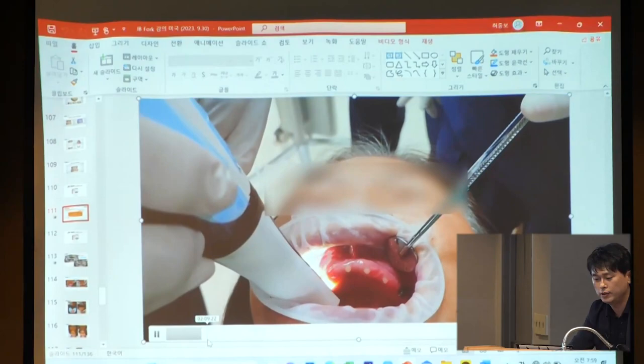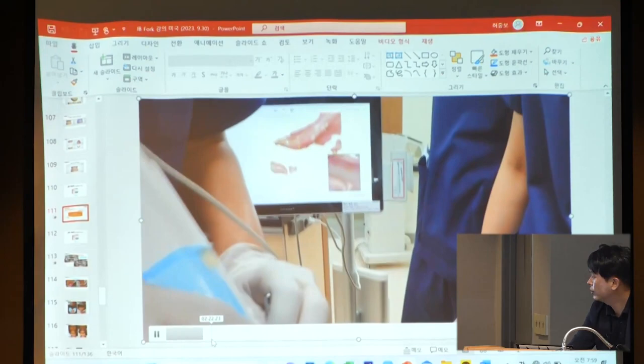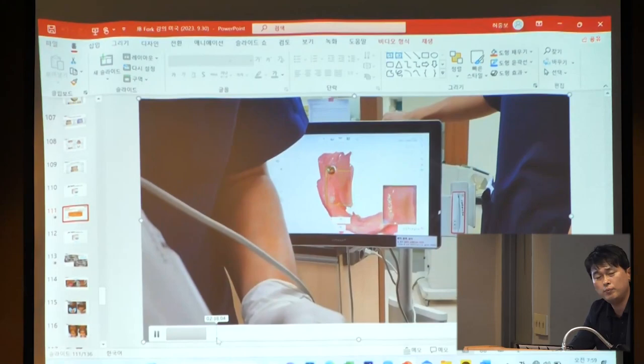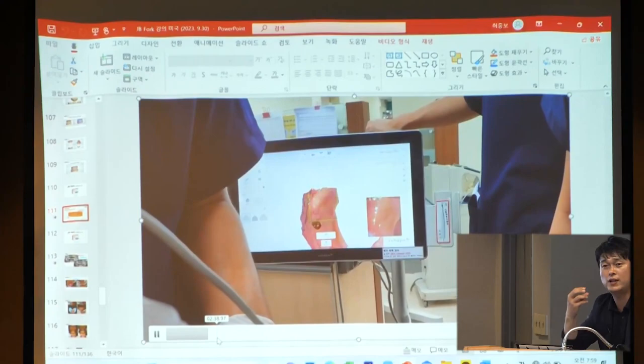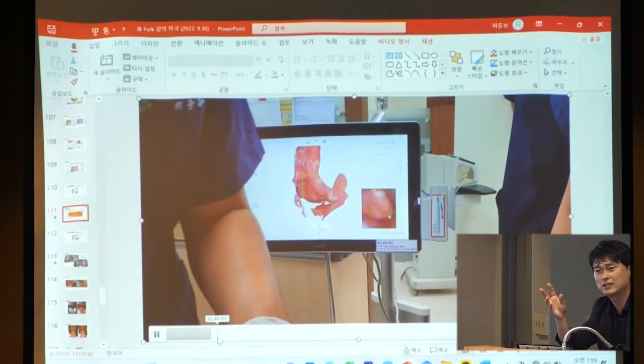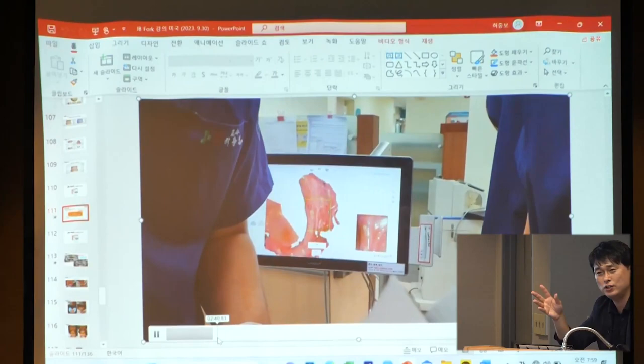After attaching the references, scan with the intraoral scanner like this. If you don't have one, you had better take an impression with alginate or silicone material. But you have to be careful when you take an impression with silicone material. The reference points will be detached. Be careful. You know, alginate has no problems. So when you make the reference points, you had better make enough, 5 or 6. So if two of them detach, there's no problem. Okay.